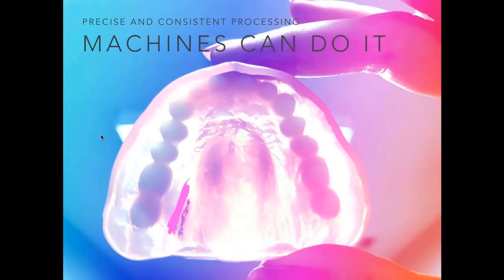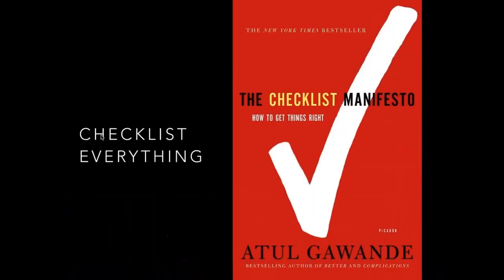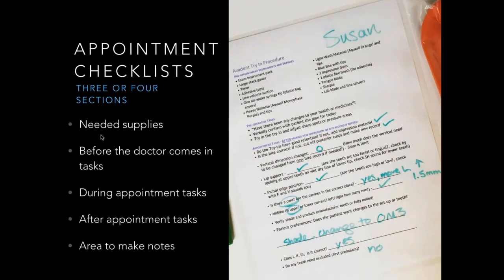So we know that machines can do this, but the humans are what usually get in the way. So the last part here is I have created checklists in order to help control the human aspect of it, because the humans are the glitches in the digital denture process. For example, it is difficult to really truly see what a denture is going to look like on a computer screen until you get it. There are a lot of errors that humans make because we're not doing a final try-in. If you do not specify the correct shade, you will get a denture with the incorrect shade. So there's a lot of room for problems that I have worked with in trying to make sure that we have a great checklist for each appointment.